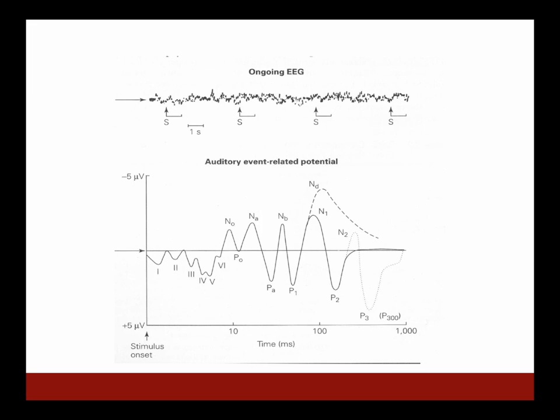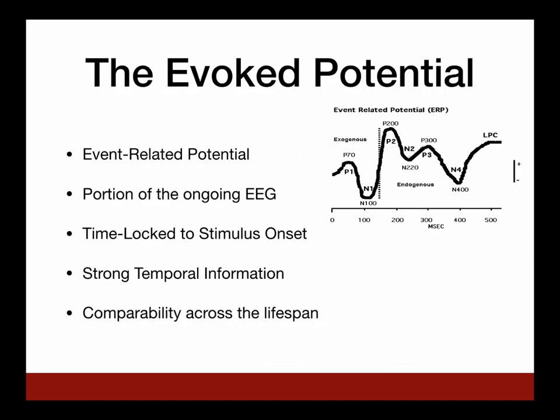And you'll notice that in this particular plot, the ERP is plotted with the negative amplitude up. Much like driving on the wrong side of the road, I discourage this highly, but nonetheless, you will see a lot of ERP papers with negative plotted up. There's a very long story, and if you want to hear about it, I'd be happy to tell you the story of why negative is plotted up, but for now, we'll just keep on moving.